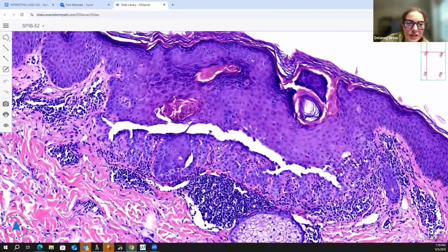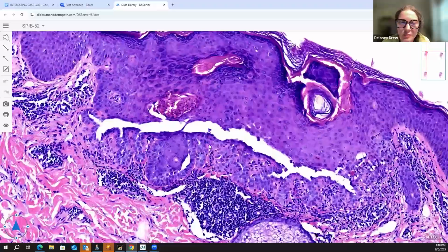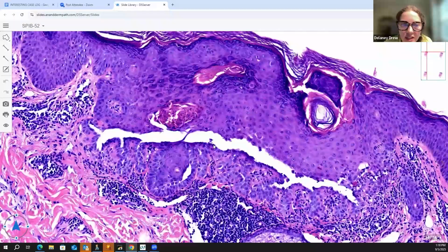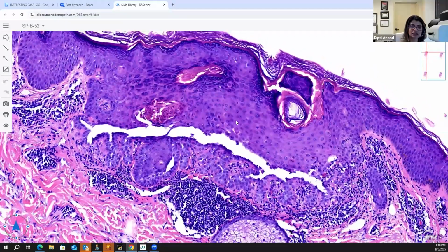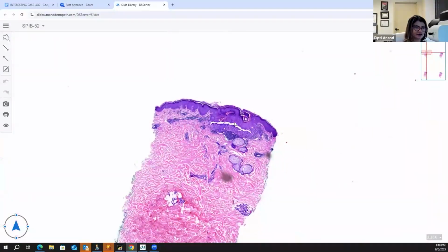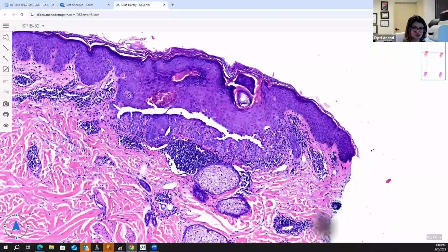For this one, I just see a solitary papule of dyskeratotic acantholysis. So I call this a warty dyskeratoma. So a warty dyskeratoma has to have a nice endophytic architecture with the verrucous stuff on the top, right? Yes. Yeah, this is the pattern of acantholytic dyskeratosis, but this is Grover's disease.